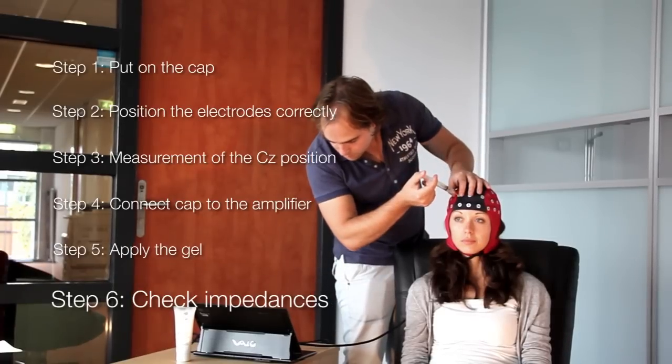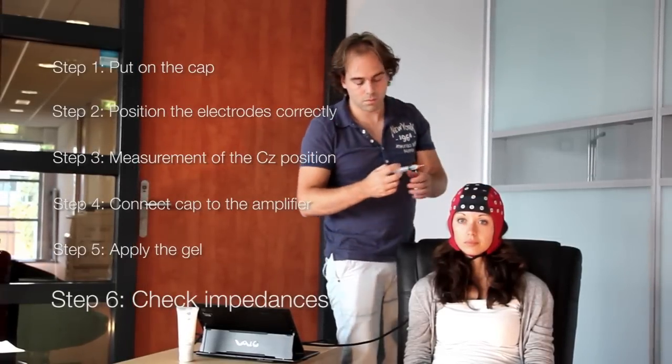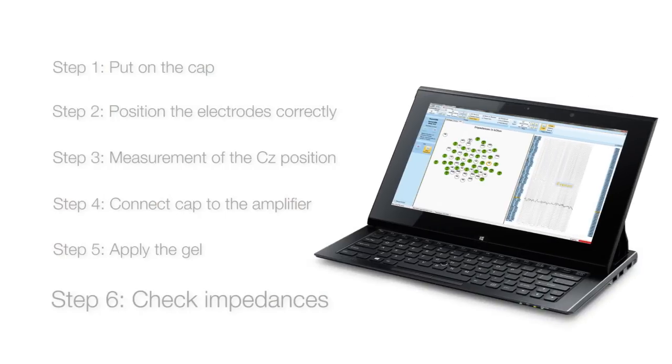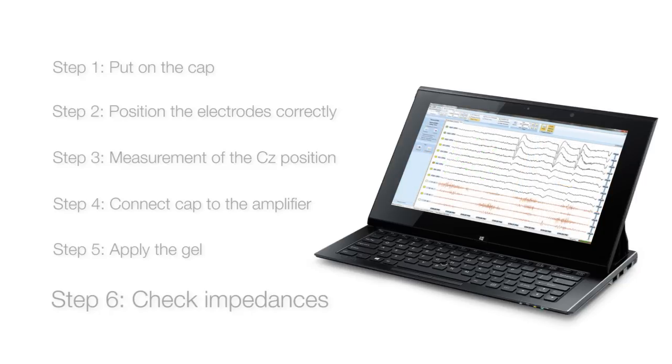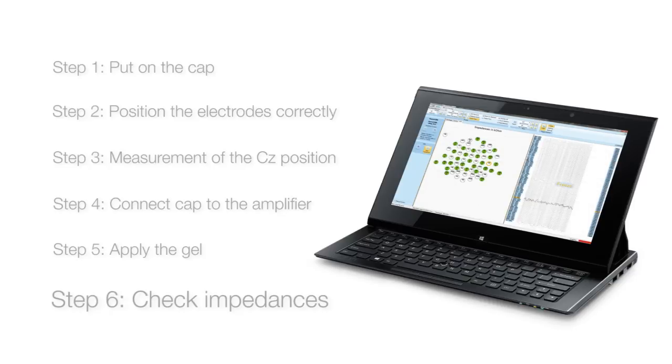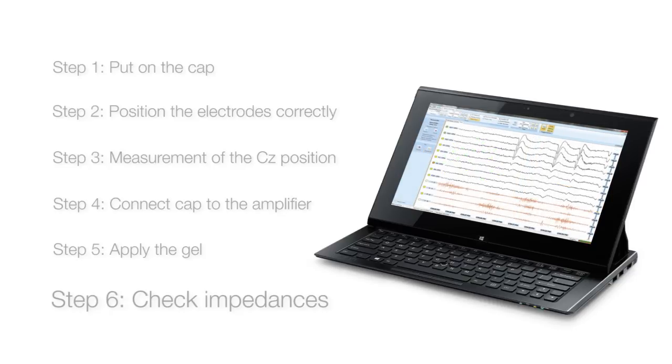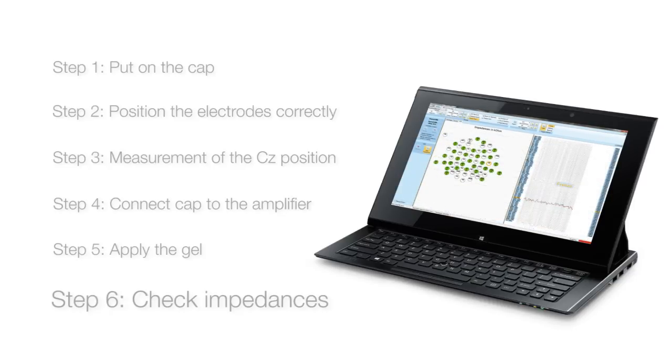Verify that there isn't too much drift or noise on any of the channels as these may be symptoms of high impedance. Acceptable electrode impedance levels are dependent upon the quality of your EEG amplifier. It may be helpful to switch between the impedance check mode of your EEG system and the signal display mode while confirming that the connection is satisfactory.